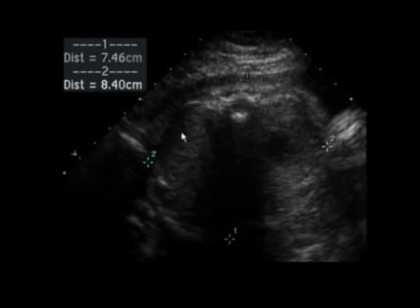So let's look at a few examples. In this instance, we have a prone fetus. The fetal spine is at the top of the image, and that's a pretty good cursor. But this one is a little bit more difficult to say where the true edge of the fetus is. Same thing over here.